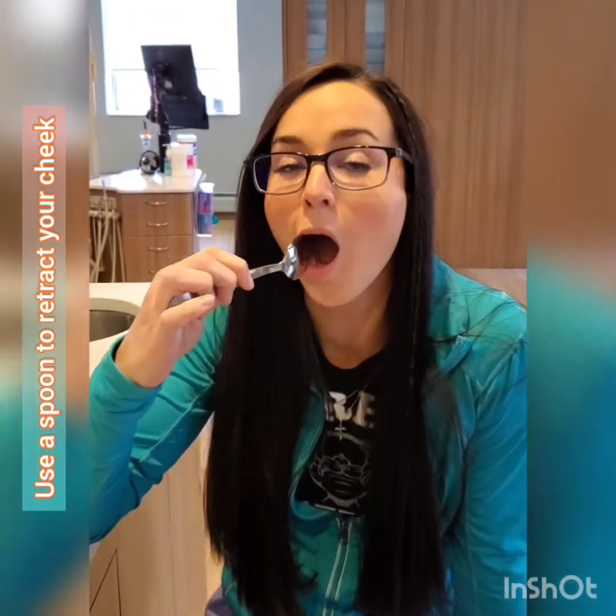Alright, so what you can use is a spoon to retract your cheeks and your lips to keep them away from these household items, like so.